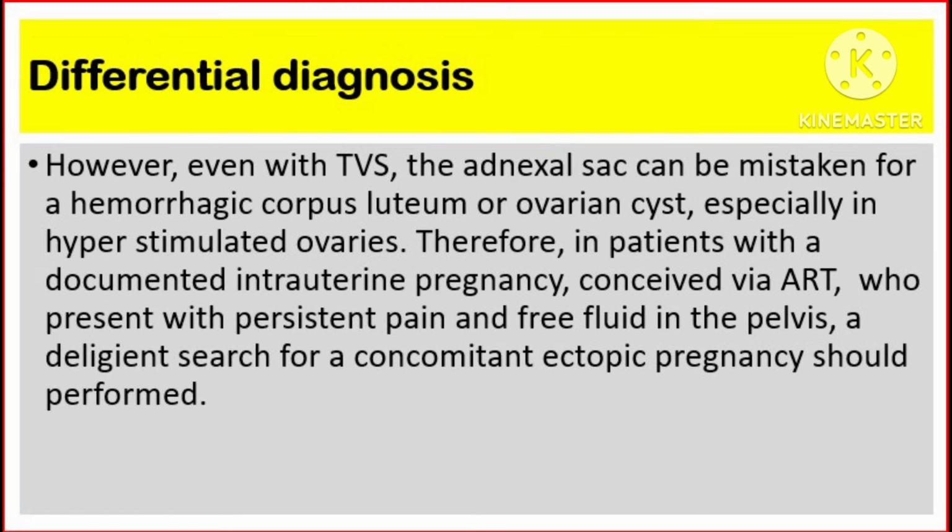However, even with transvaginal sonography, the adnexal sac can be mistaken for a hemorrhagic corpus luteum or ovarian cyst, especially in hyperstimulated ovaries. Therefore, in patients with a documented intrauterine pregnancy conceived via assisted reproductive technologies who present with persistent pain and free fluid in the pelvis, a diligent search for a concomitant ectopic pregnancy should be performed.